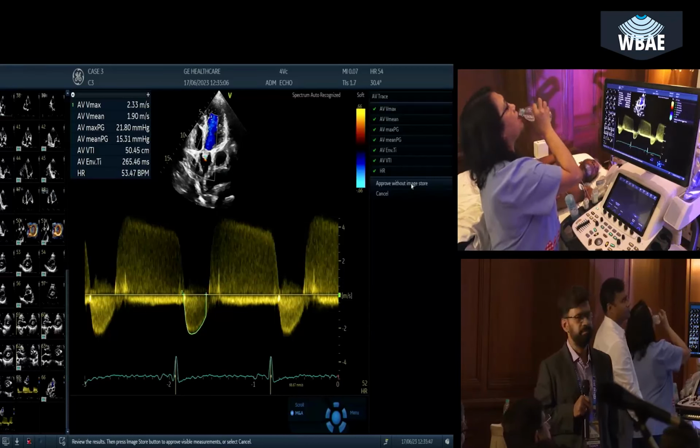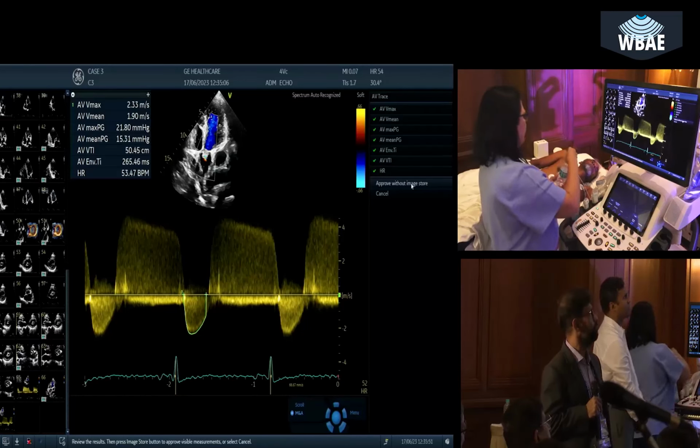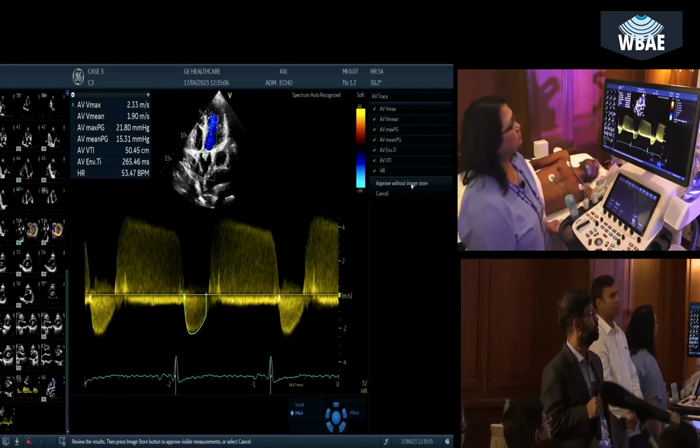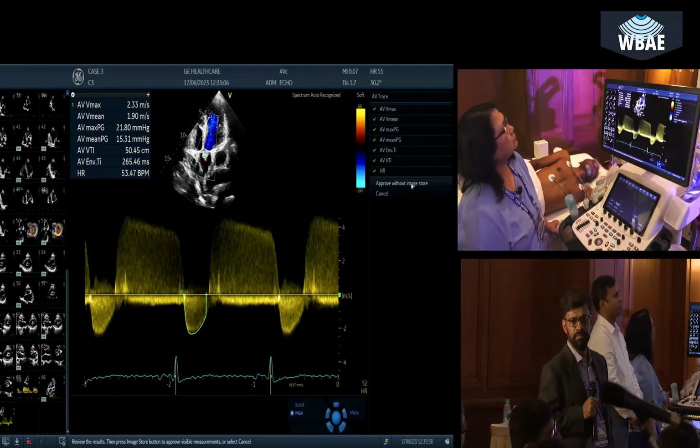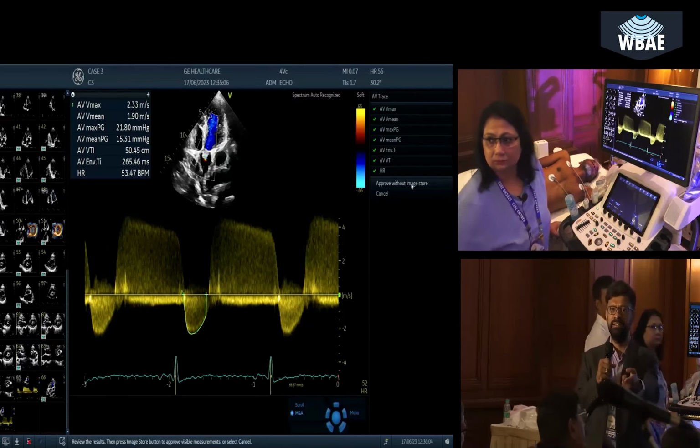But you know, we were discussing, saying the aortic VTI is 50, and we had calculated the stroke volume 55, 56. 55 divided by 50, you are still getting area 1.1, 1.2 centimeter, which is pretty much fitting with everything. Are you guys getting what he did?